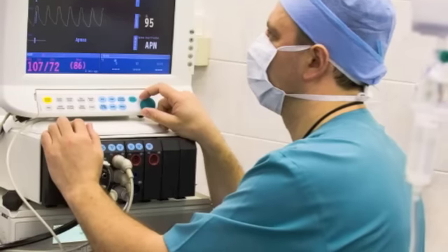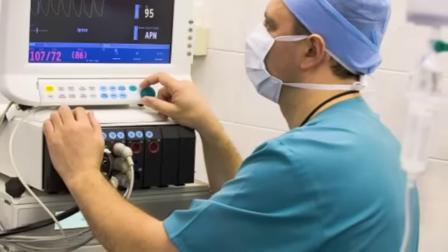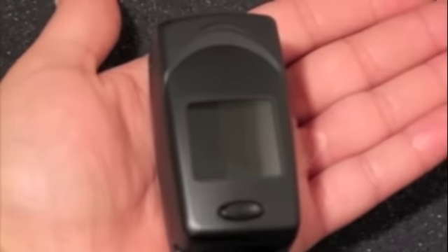Gone are the days of the bulky pulse oximeter machines typically found in hospitals. Introducing the revolutionary new Landon Medical PC60C Fingertip Pulse Oximeter from PulseOximetersDirect.com.